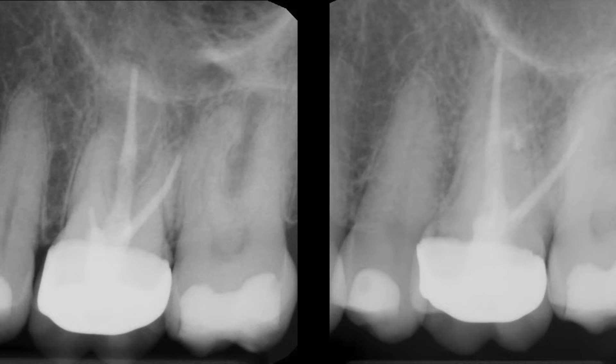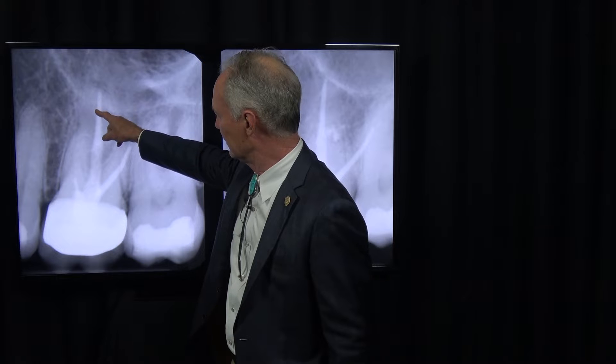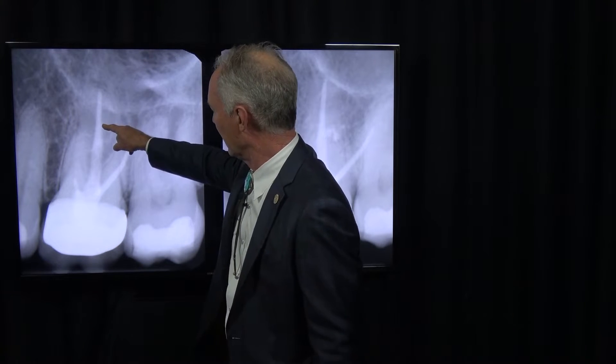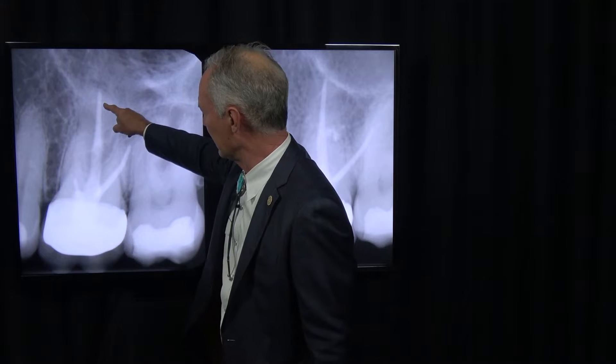In this case, you can see this patient had an old endodontic procedure and was having discomfort from the tooth. You can see the infection here on the mesial buccal root — it's slightly filled and they were not able to enter that root.